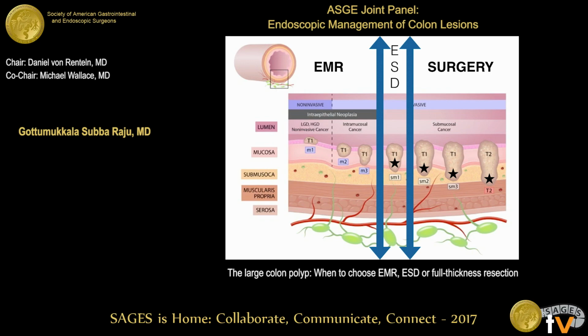You can safely resect up to 20 millimeter lesion with en-bloc snare resection, maybe 25 millimeters if you push, and if you're lucky to align your snare well. But beyond that, it is hard to resect by endoscopic mucosal resection with a snare, and in those cases, using ESD is the way to go. And if you look at that original data that I've shown that Doug Rex has put together, that is basically 1 in 10 that may end up going for surgery if you practice high-quality endoscopic mucosal resection. So something to keep in mind.